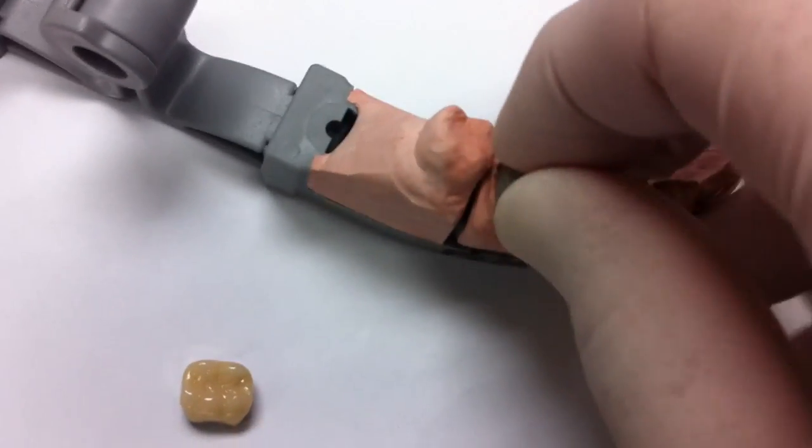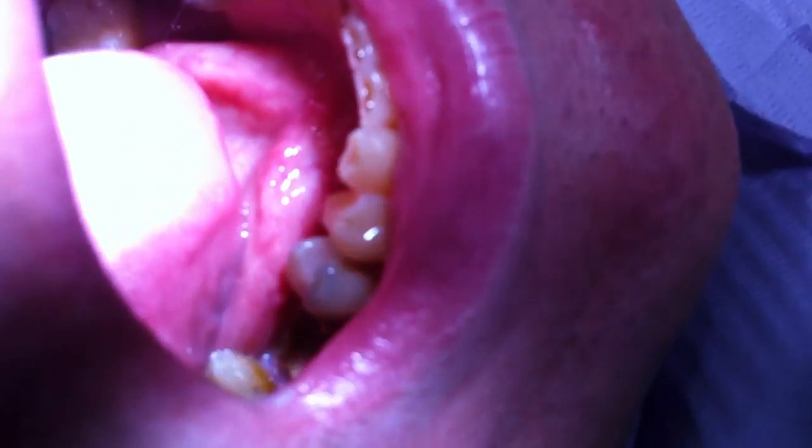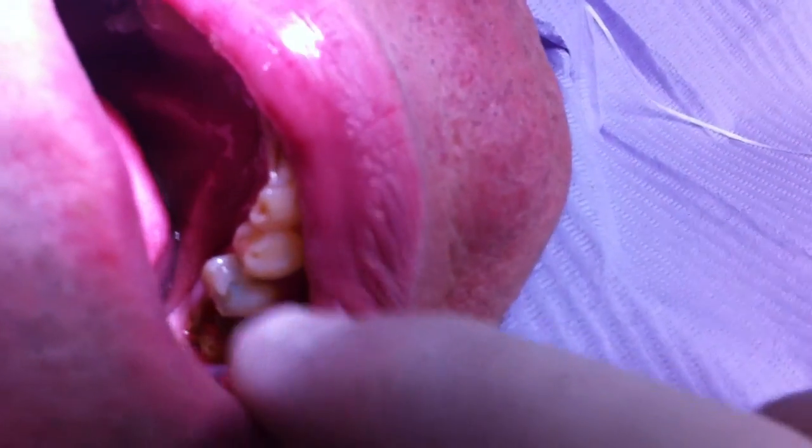Now I can get this post off. Here's the patient — there's the mouth. Just turn towards me a little bit, please. Thank you. Let's take a look at the tooth preparation. As you can see, there's very little tooth surface left.